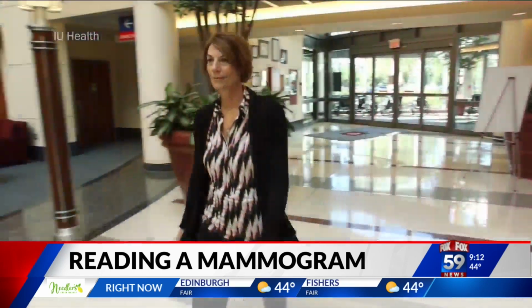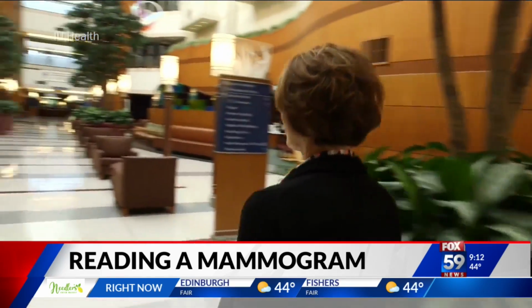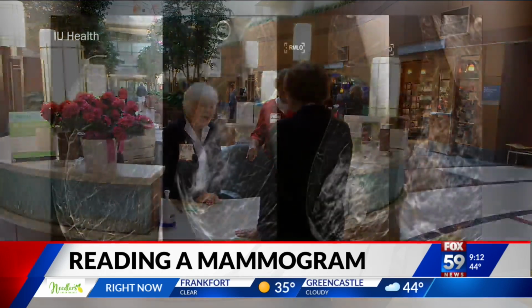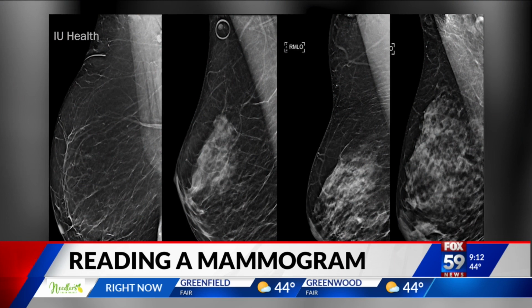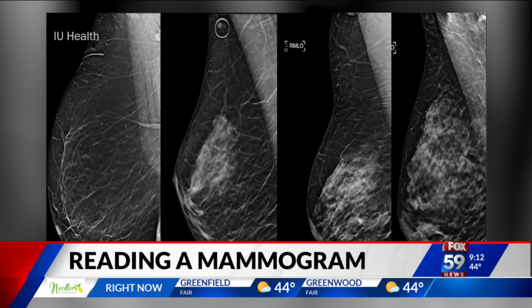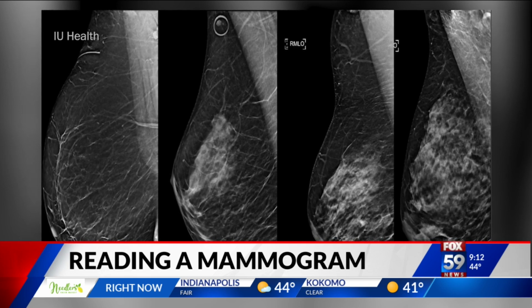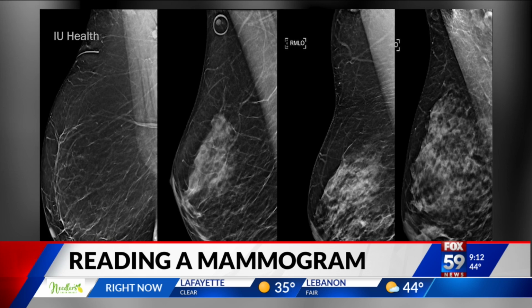And the breast is made up of primarily fatty breast tissue, fibroglandular elements, and fibrous elements. So if you have dense breasts, you're someone who has mostly fibroglandular and fibrous elements, which show up as white densities on the mammogram. If you're fatty, you're mostly dark areas of fat on the mammogram, which make it much easier to interpret. And so this is something you can look at and you can tell right away. Right, we look at that and then we also notify your physician, so you can find out in your report or from your physician which category of patient you fall into.